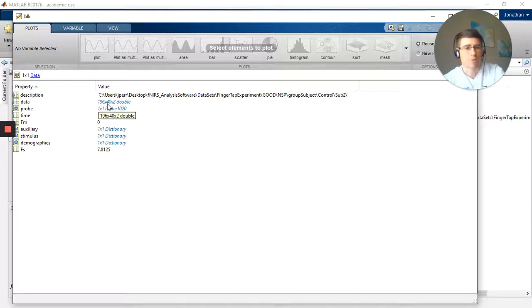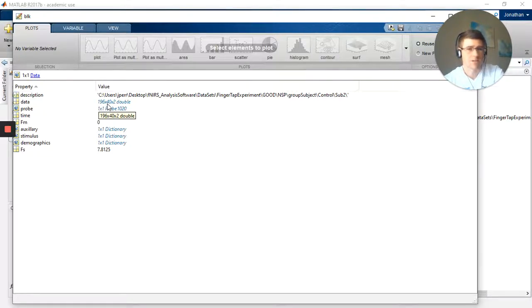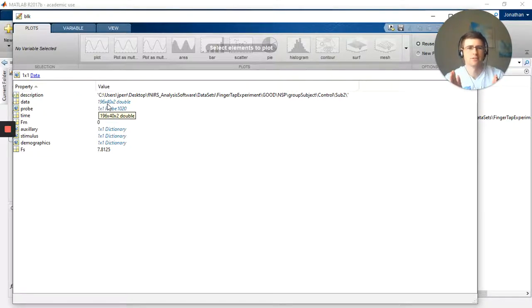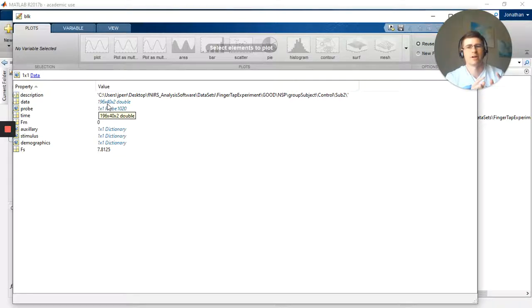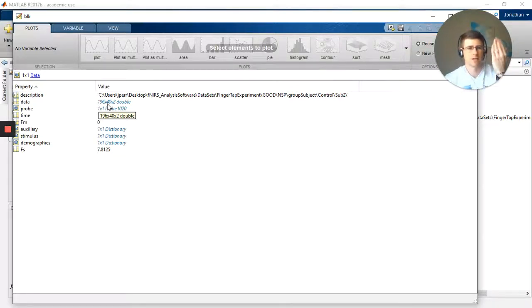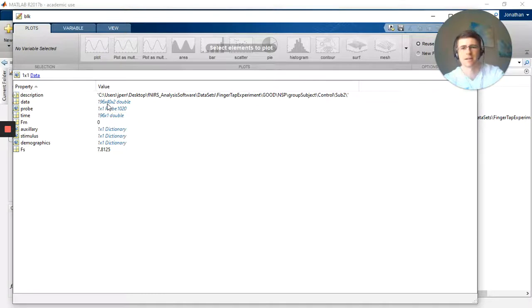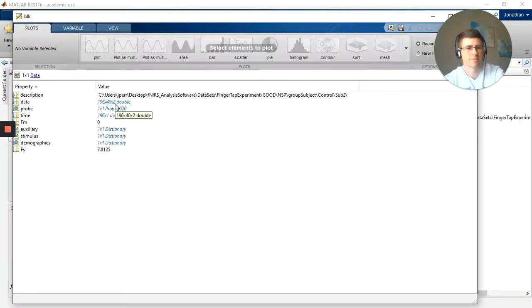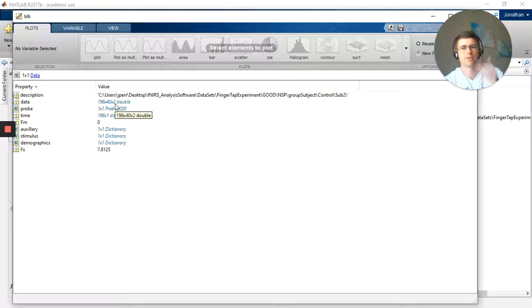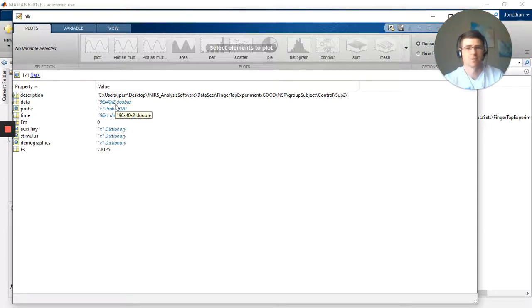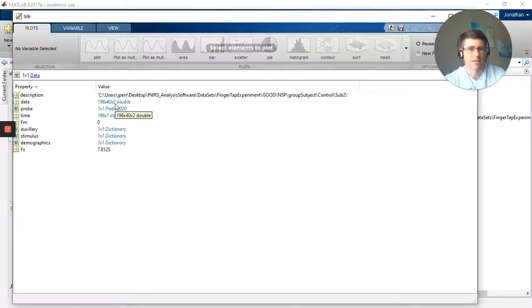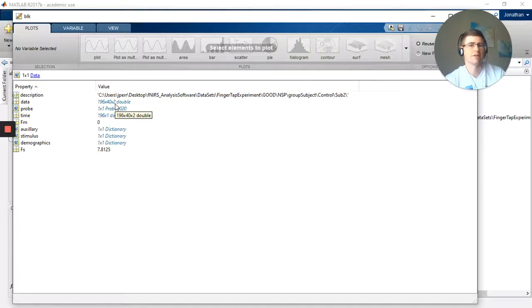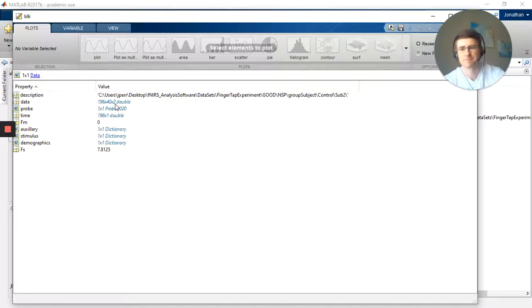I have 40 channels, 40 columns excuse me, which is still 20 channels times 2, because now I have oxy and deoxyhemoglobin. Oxy, deoxy, pasted together, concatenated together. Then I have this third dimension. The third dimension is my conditions. I have condition 1, condition 2, or 1 and 15 if you recall. It was left and right finger tapping. If you have more than two conditions, you'll have more than two as this third dimension.